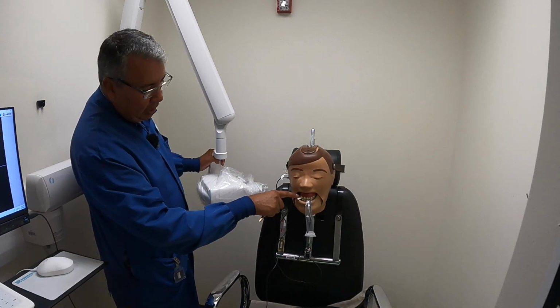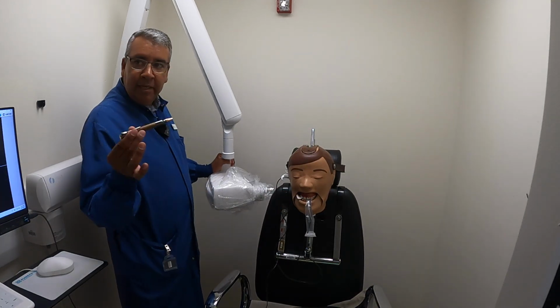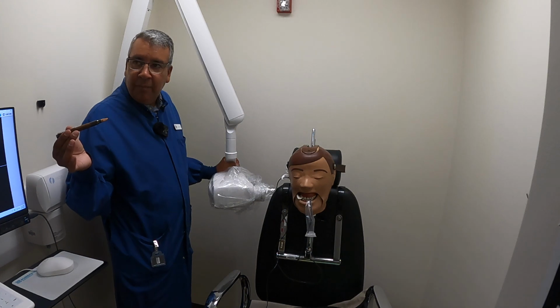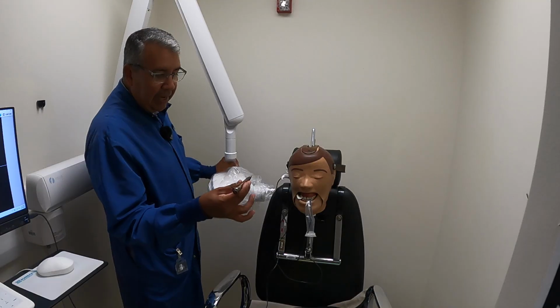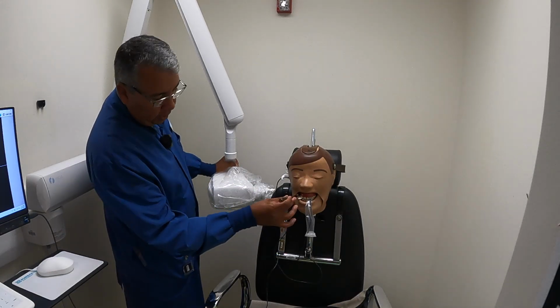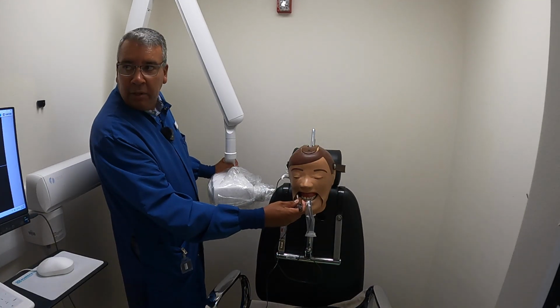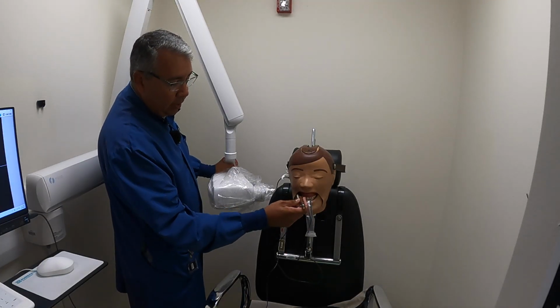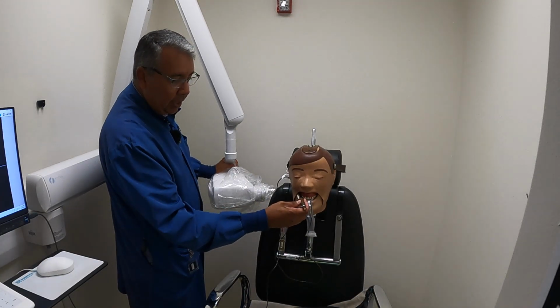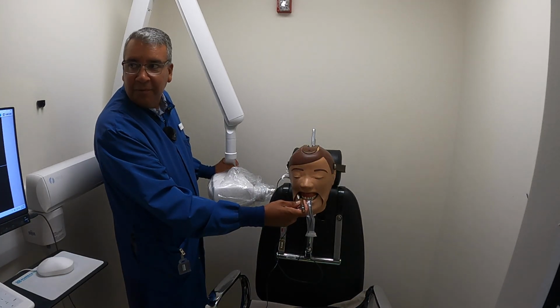So we have to take a look at the second premolar, the first premolar, and the canine. Now, you can use your pens for a little while, but this only lasts so long, because we can't stick pens in the patient's mouth. But if I lean this up against those 3 teeth, or even 4 if I include the molar, this is the horizontal angle of those 4 teeth. It's not going straight. If I lean that right up there, that is the horizontal angle. If I lost you, feel free to let me know. We all understand that? Good.